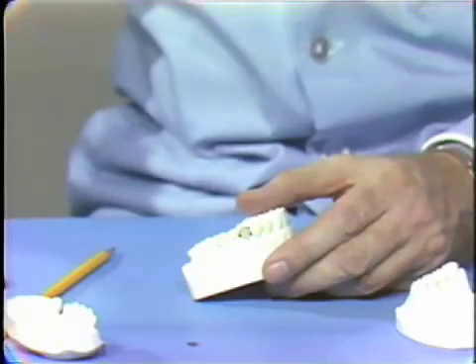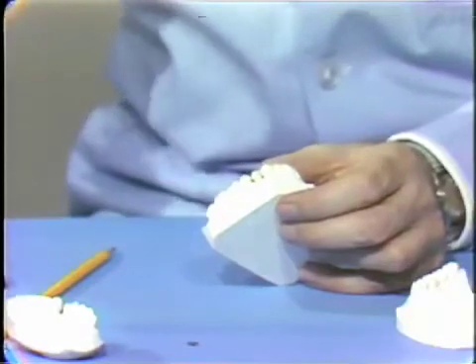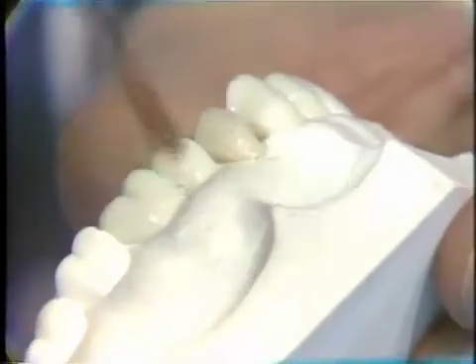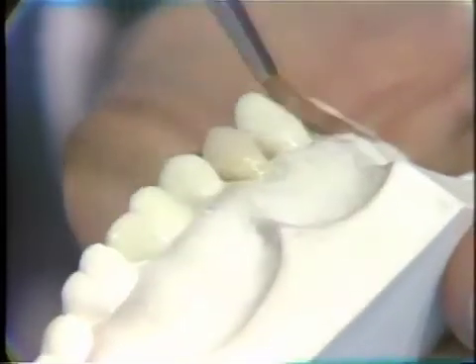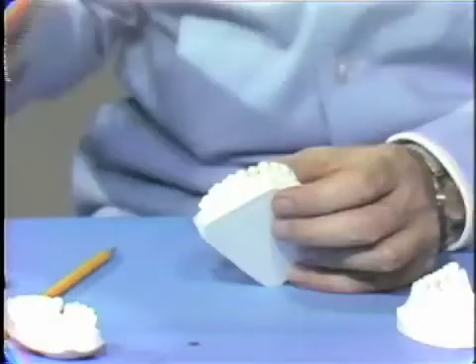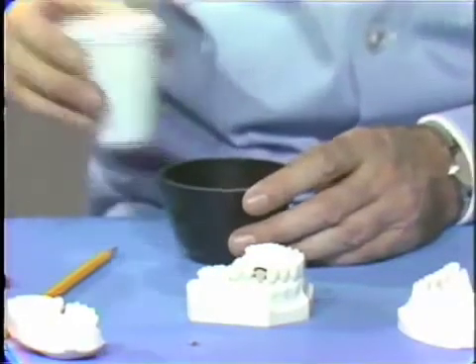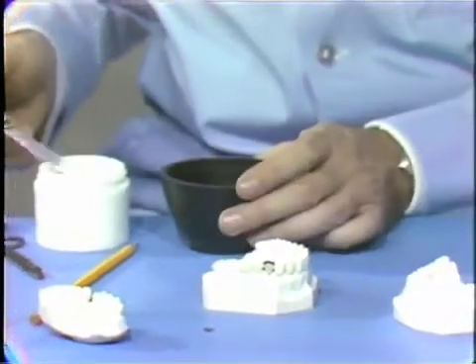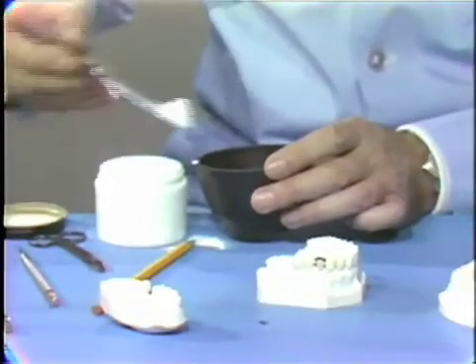Some separating medium is necessary here, and in this particular situation the cleanest and the best one to use is just a little ordinary household soap and water on an inlay brush. Just paint this over the adjacent teeth and the mucosal area around there and the pontic itself, so that the plaster core will not stick to that. You can use other materials for this, but this will be the cleanest and the neatest one to utilize. So now we're going to mix a little impression plaster, and with the impression plaster make a small core to locate that pontic in the position which we've selected as being the best one for the particular situation.